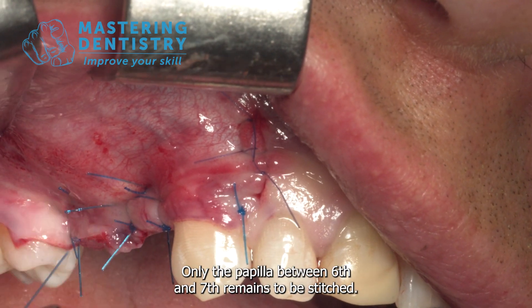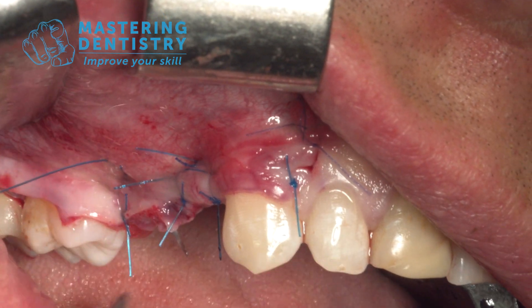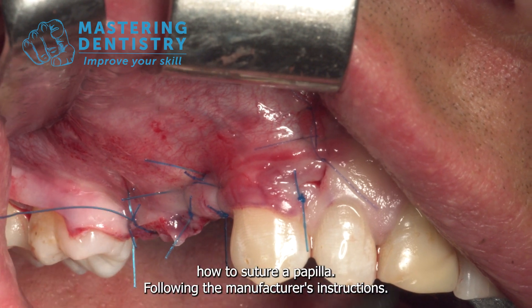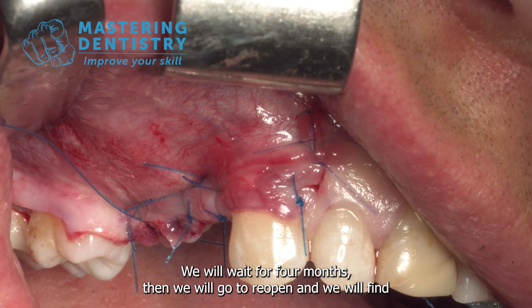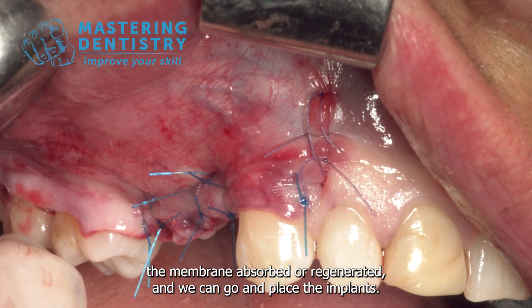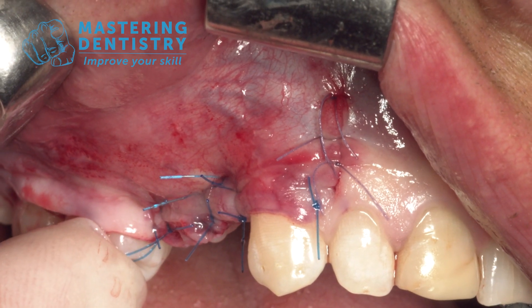Only the papilla between the 6th and 7th remains to be stitched, which I'll spare you from filming since it's just a senseless nightmare back there — I think it's obvious how you stitch a papilla. Following the manufacturer's instructions we will wait four months, then reopen and find the membrane absorbed, the bone regenerated, and proceed to place the implants.